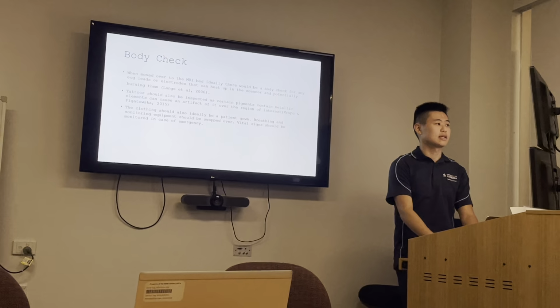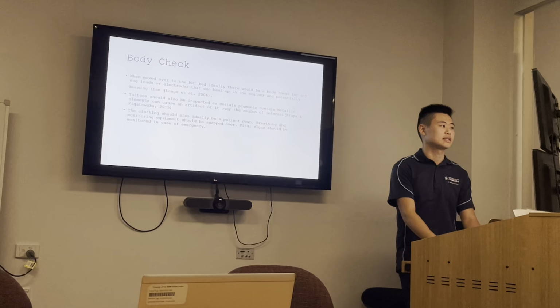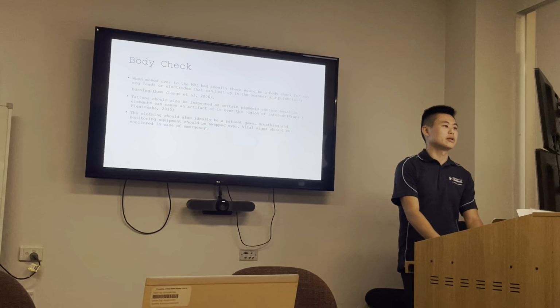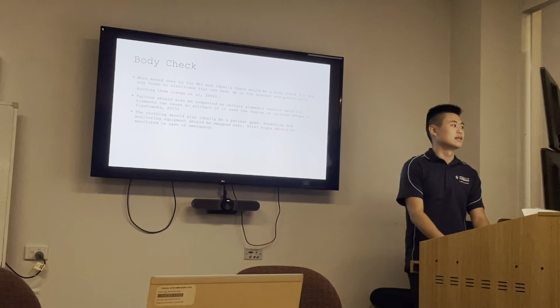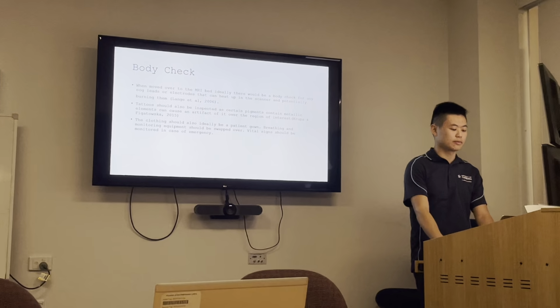Tattoos can also be inspected as certain pigments contain metallic elements and can cause an artifact if it is over the region of interest. The clothing ideally should be a patient gown, as previously stated, as other clothing can cause static artifacts. Breathing and monitoring equipment should be swapped over, and vital signs should be monitored in case of emergency.